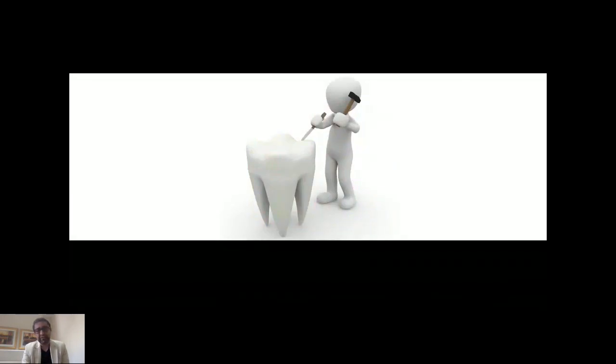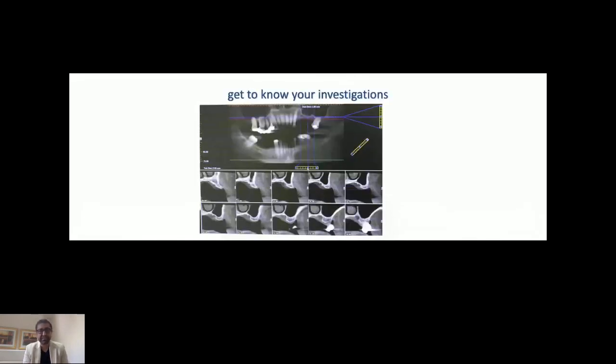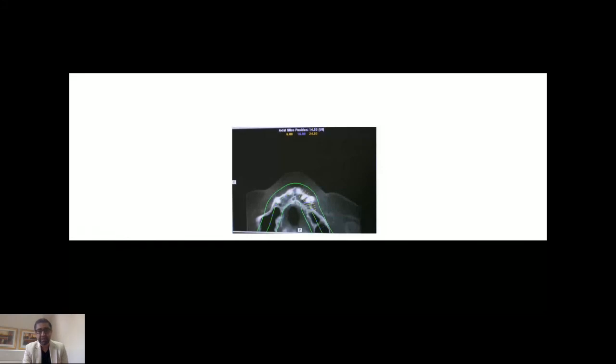As dentists, we are very good at work, we are very good at drilling, we are very good at hammering, but we need to be minimally invasive for our patients. So think about the ways you can be minimally invasive. You need to know your investigations, you need to know your anatomy, there's no doubt about it. If there is something you cannot understand in a CBCT, then get an advice, get it reported, let the radiologist have a look at it, and get an advice from the ENT. So you need to know your diagnosis and your investigations. Likewise, you can see there's a septa showing in the CBCT, so you should be aware of what you need to do when you're going to do the sinus lift with the septa.